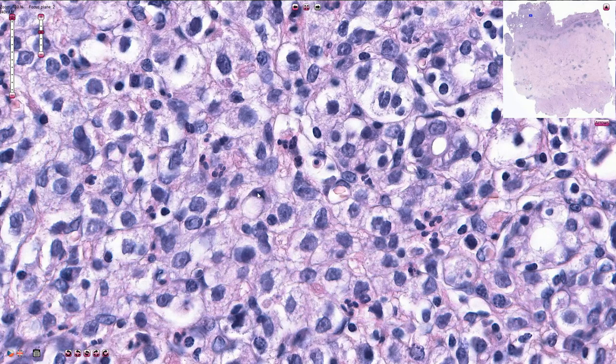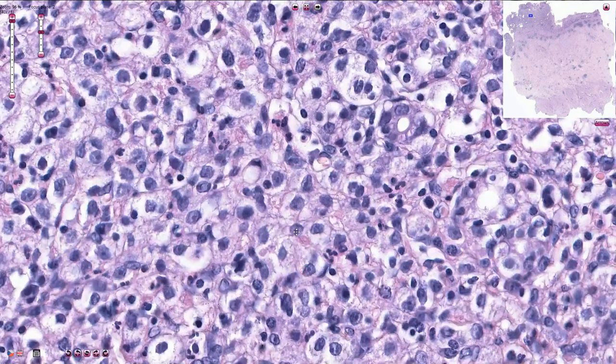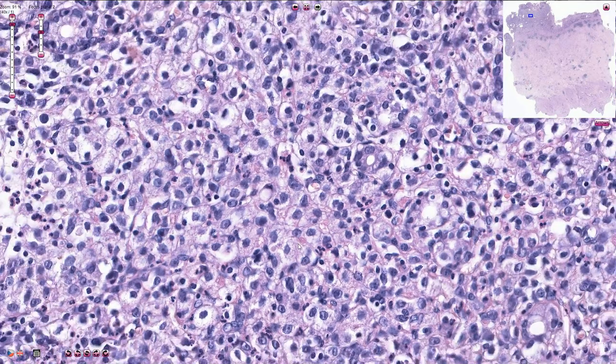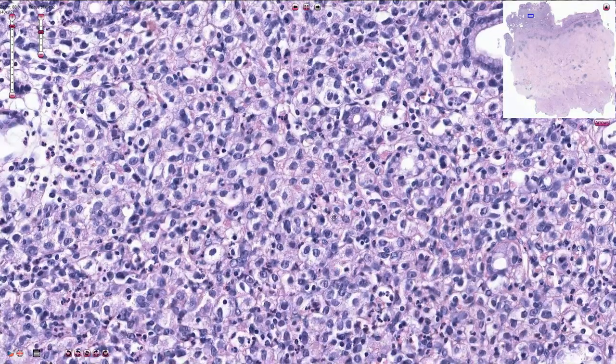Because of the mucinous cytoplasmic content, all of these cells would be strongly positive for PAS stain, which is sometimes quite useful.